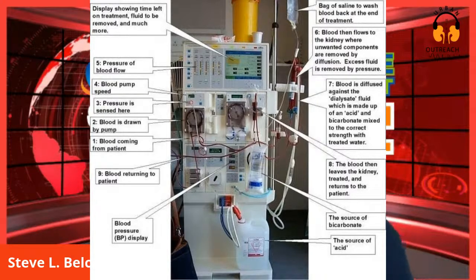You can monitor the pressure of blood flow right there. You can monitor the arterial pressure and venous pressure right on that screen where number five says pressure of blood flow. Normally there's a saline bag at the top right of the screen - a bag of saline to wash blood back at the end of treatment. That bag is also used to administer saline if you're cramping or experiencing hypotension or low blood pressure.